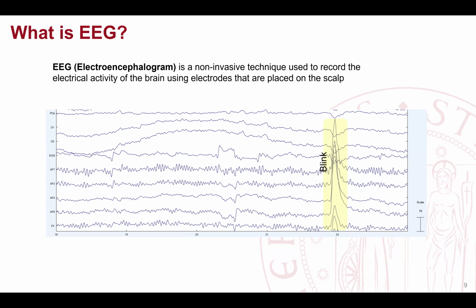Normally, a single signal is in the order of 10 microvolts, probably lower. So it's a very, very tiny signal from which we need to extract the information. And the main problem is that on top of these signals, which are already very small, there is other activity which, as you will see better later, are artifacts. So they are generally not useful information for us.